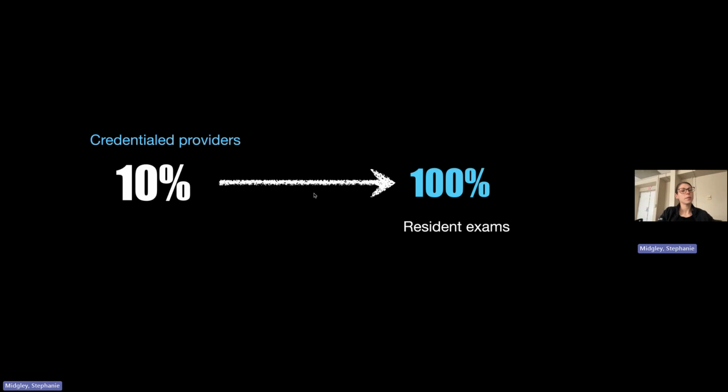So the other thing becomes, how many exams are you going to QA? For credentialed providers, attendings, you can QA as little as 10% to none of their exams, because your argument is that they're credentialed and have privileges and have demonstrated proficiency, so I don't need to review their studies. They know what they're doing already.